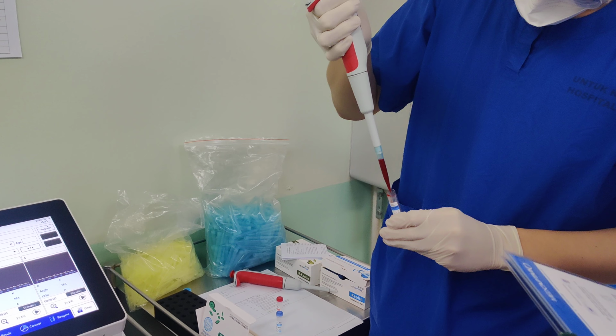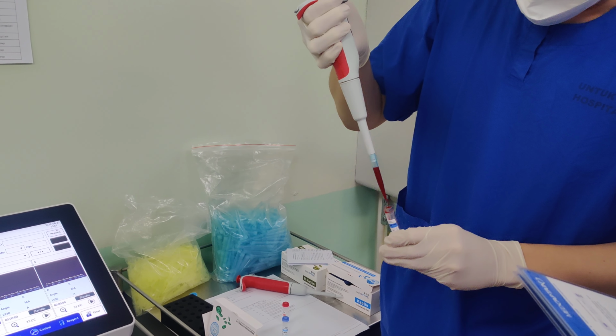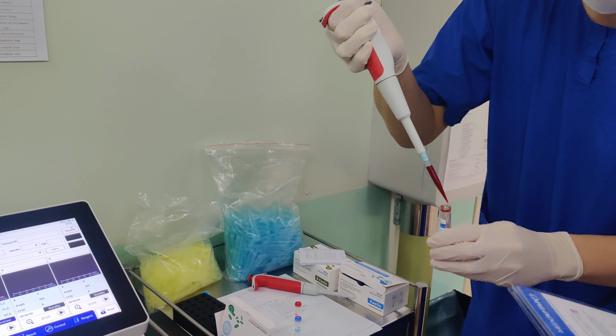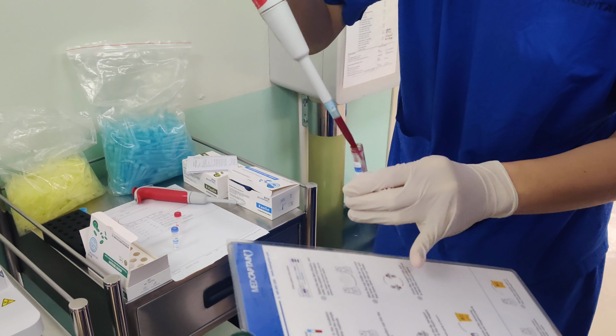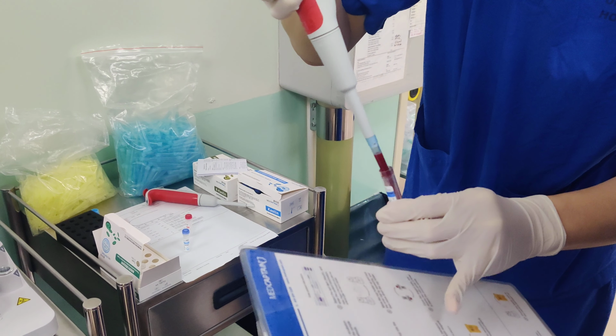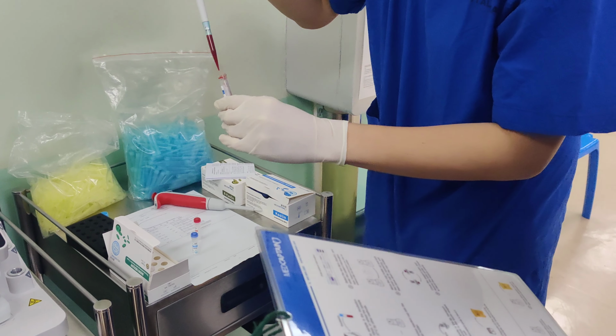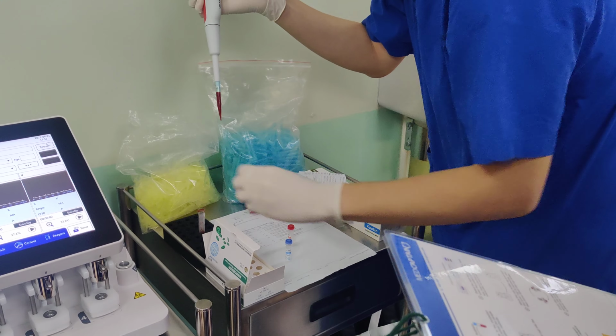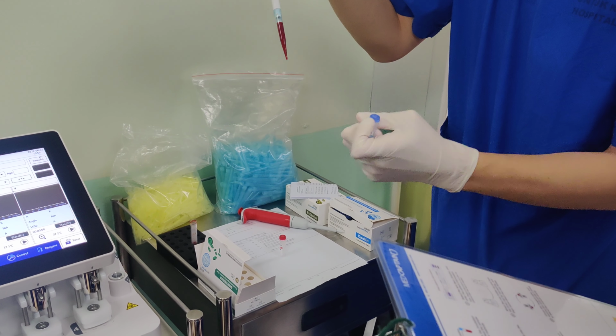As everyone can see, this will be exactly 1 ml. Then what does it say in the manual? It has to be added to the kaolin, the kaolin reagent. So remember, kaolin is the blue bottle. One test will always use one of this bottle.